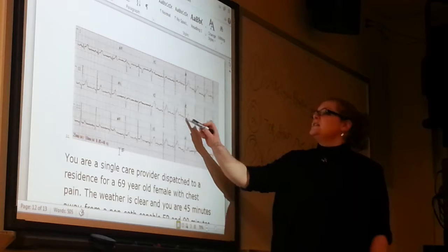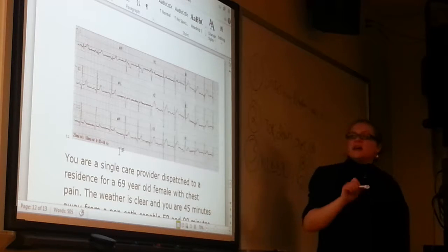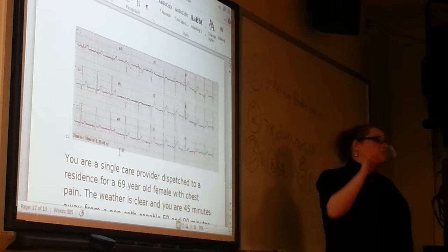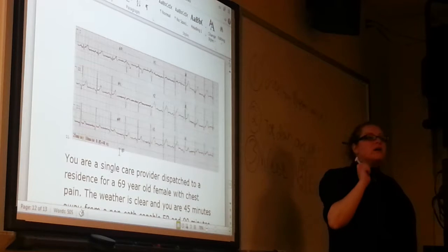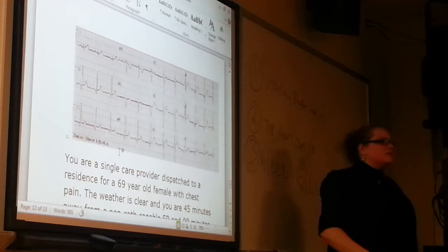So when we're looking down here, I'm going to urge you to take a closer look at this. The isoelectric line is a little funky here. It's got that weird curve to it. But look and see if there's anything in there that's clinically significant to you guys, because we're going to have a conversation. I'm going to introduce a new topic in like 2 seconds. Brace yourselves.